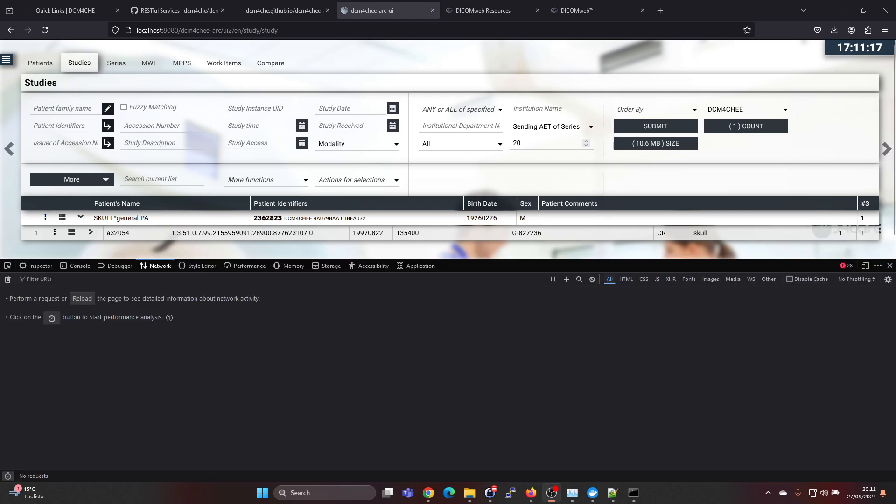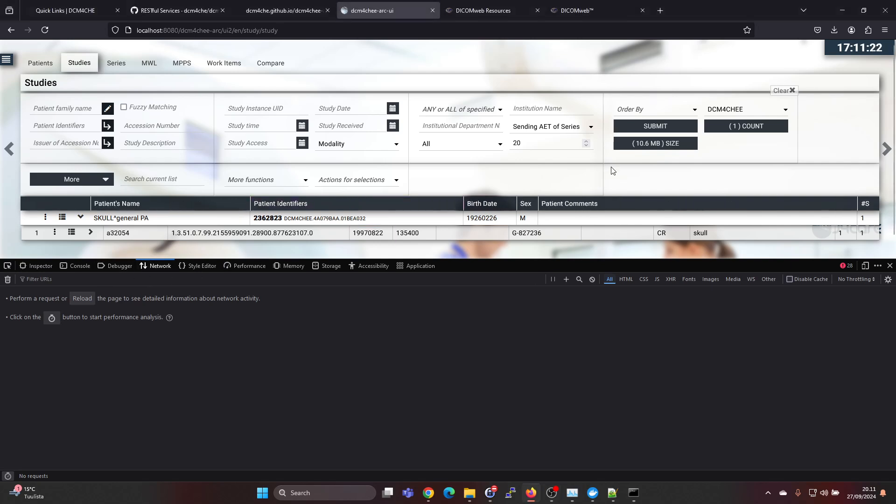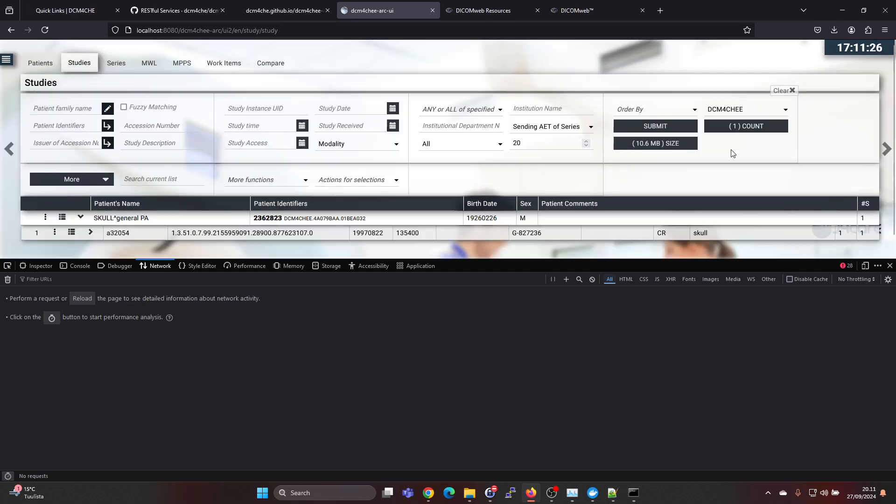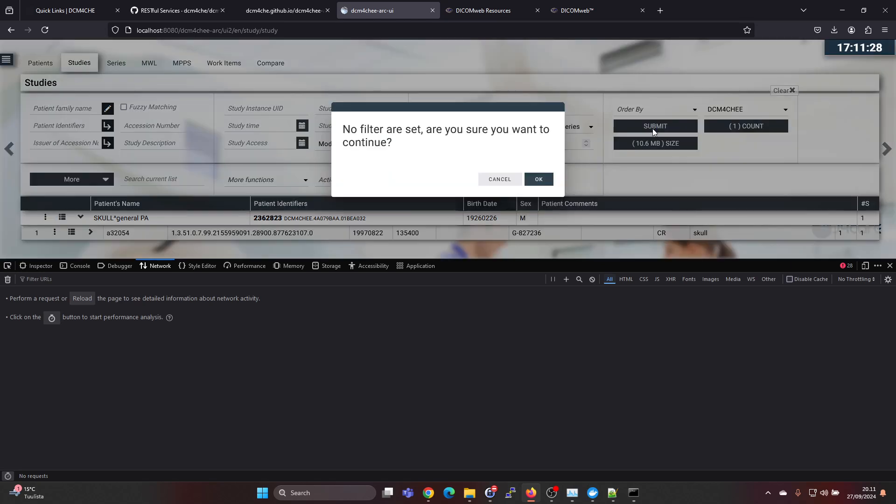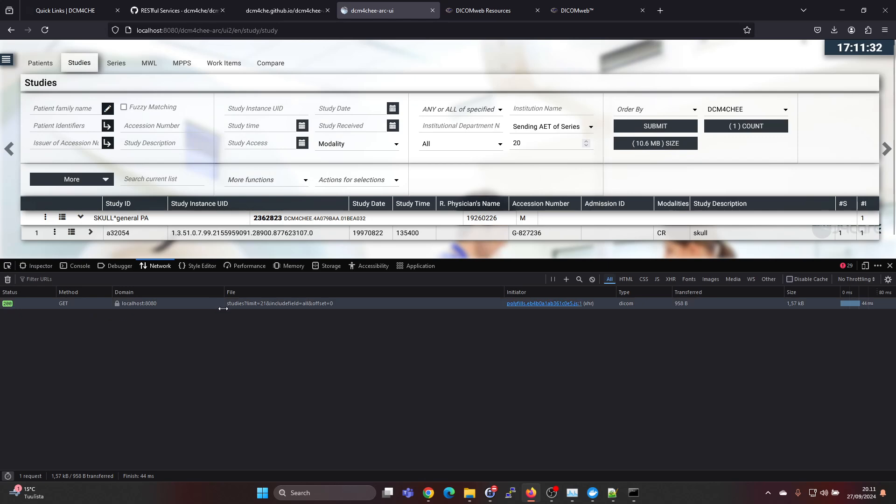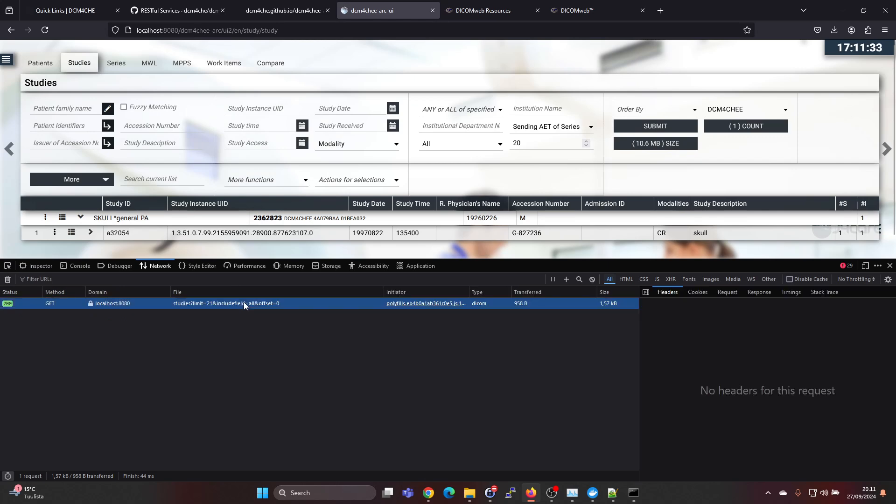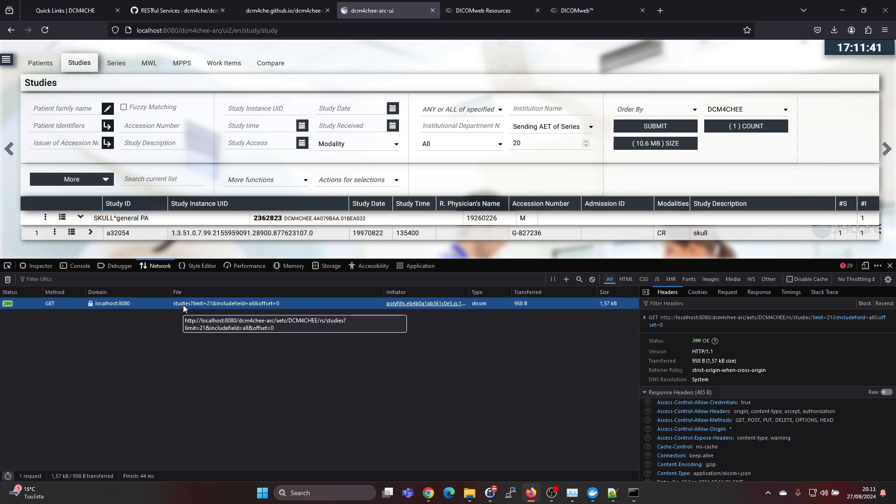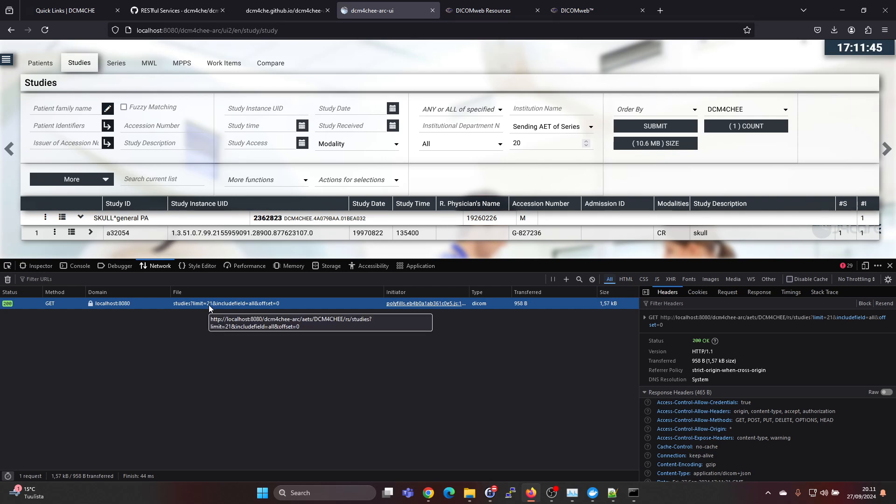If we press F12 we get the developer options here visible, and if we select the Dicom4ChE AI title here and press on submit without any filters, we will see that there is a query being sent. This query is a QidoRS query into the backend. Here we can also see the address what it is using.